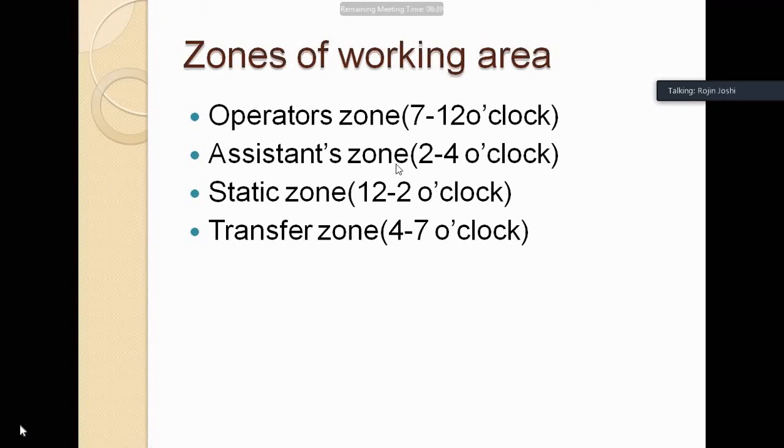Assistant's zone. Assistant's zone is where the assistant works. The assistant will always work in 2 o'clock to 4 o'clock position. The assistant won't stand behind you.